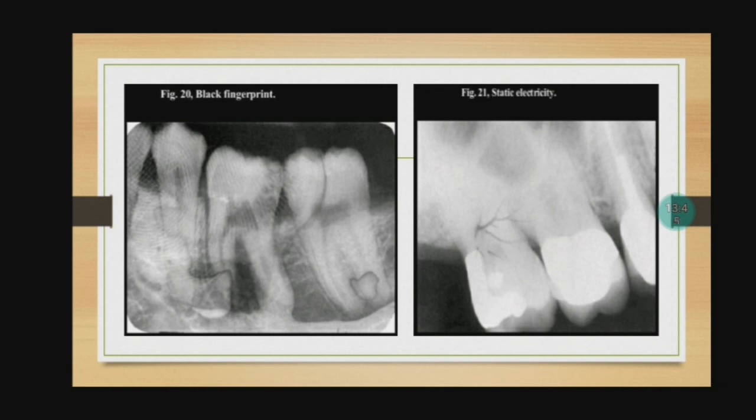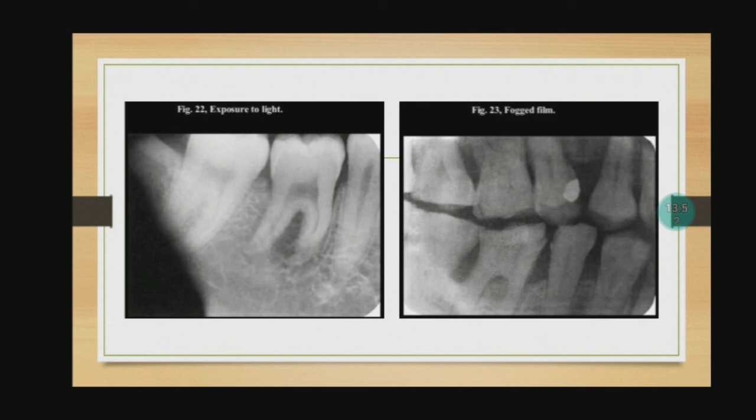Next is the black fingerprint in figure 20. Figure 21 is static electricity. Exposure to light in figure 22. In figure 23, fog film.